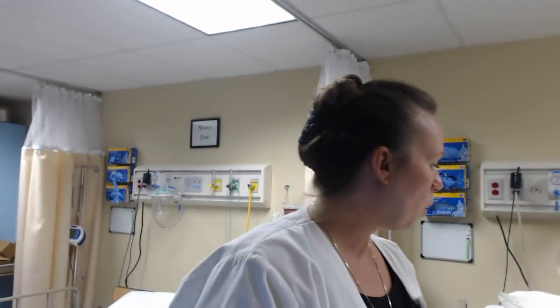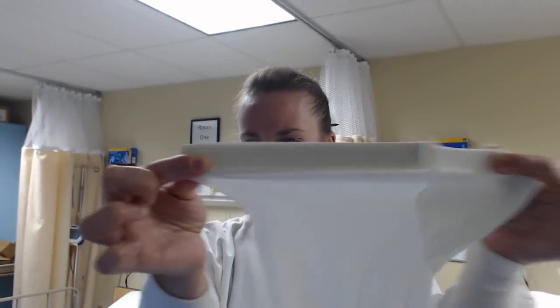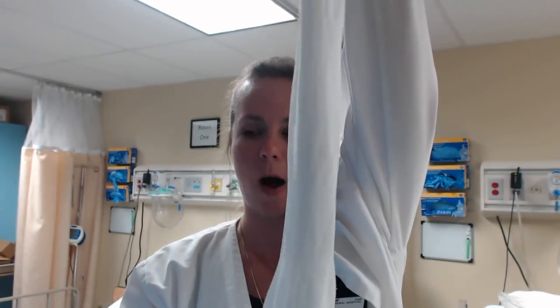Now, if it's a new sizing for TEDs, and even if there have been TEDs put on the patient previously, we need to size the patient first. Before I get into that, I want to talk about different types of TEDs. So there are what we call thigh-high TEDs, and you can see here there's an elastic band, and the TED is extremely long. And I will also pass this out in class. So it goes all the way up to the thigh of the patient.